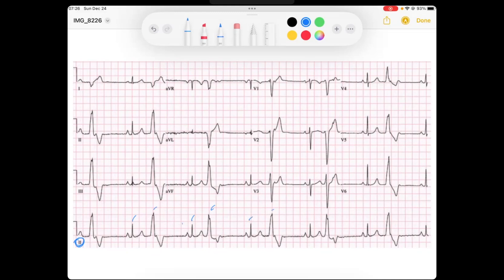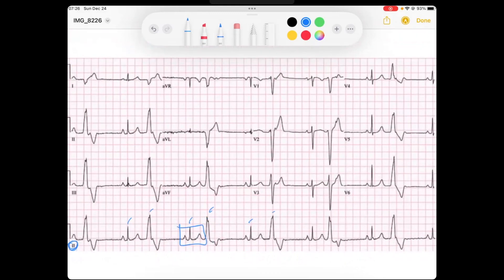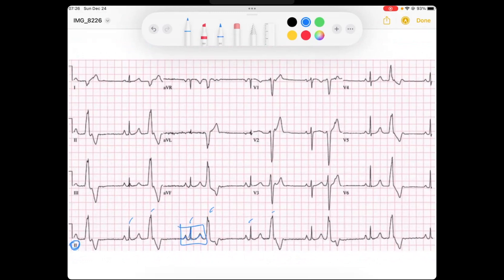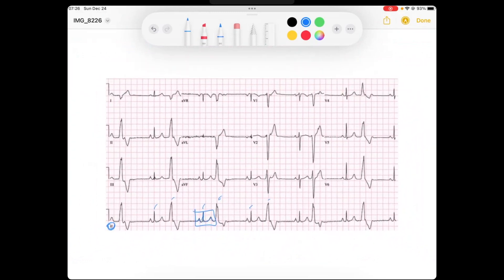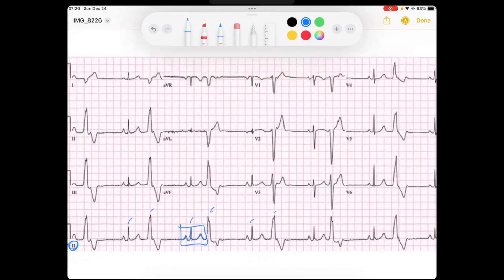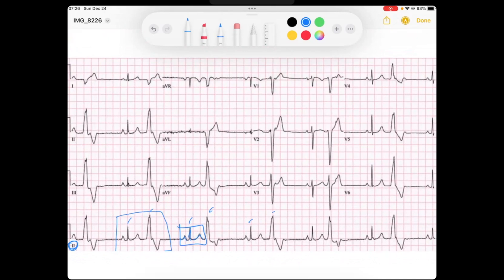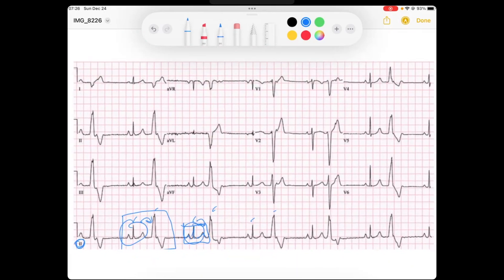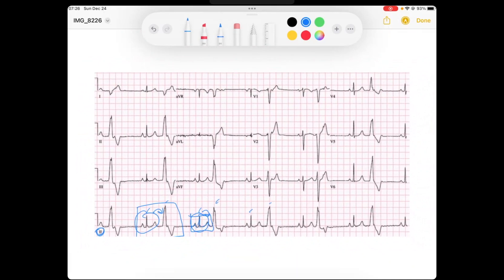It seems like the narrow QRSs, if I zoom in on them, have a P, QRS, and T. So it seems like we have this coupling of normal and then funky looking beat, normal and funky looking beat. Let's evaluate our normal beats and see what we can get.